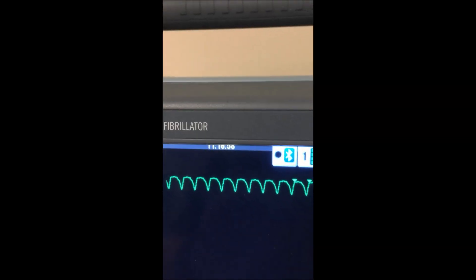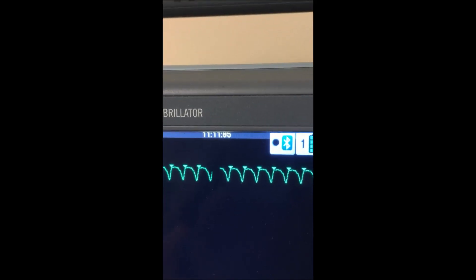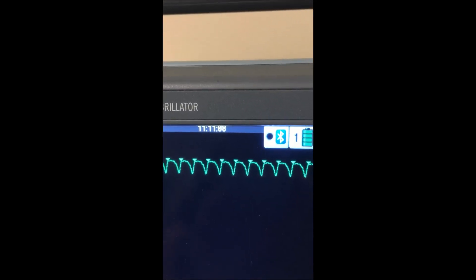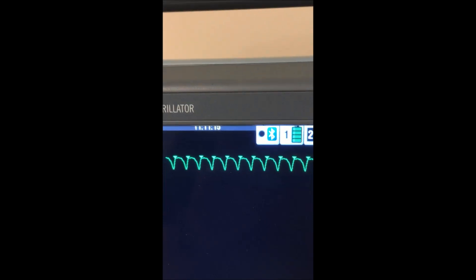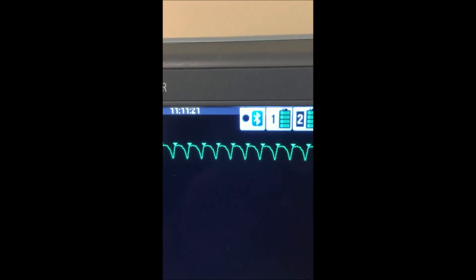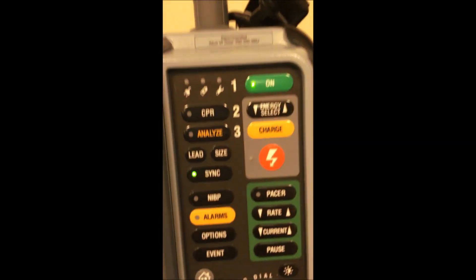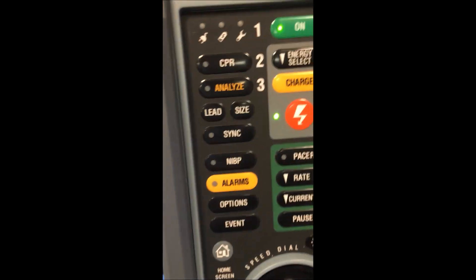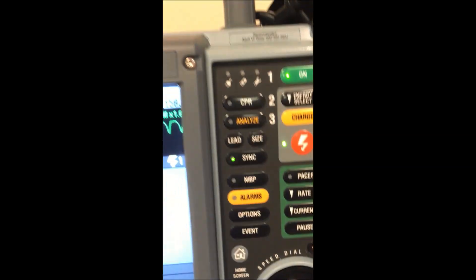We can see sync is flashing again. And interestingly enough, the machine has chosen a different part of the QRS than it was on before — you'll see this sometimes. The main thing is that you're fairly certain that it has chosen the R-wave, and you're absolutely certain it hasn't chosen the T-wave, because a shock on the T-wave is most likely to send the patient into V-fib. It doesn't have to be done in this order — if for some reason you forgot to hit sync, you can still turn the sync switch on very easily. I am going to hit charge and fire.